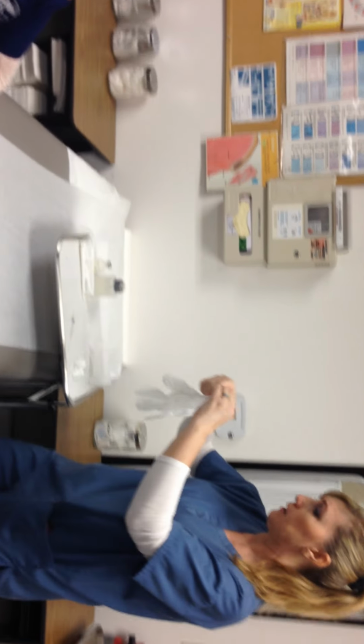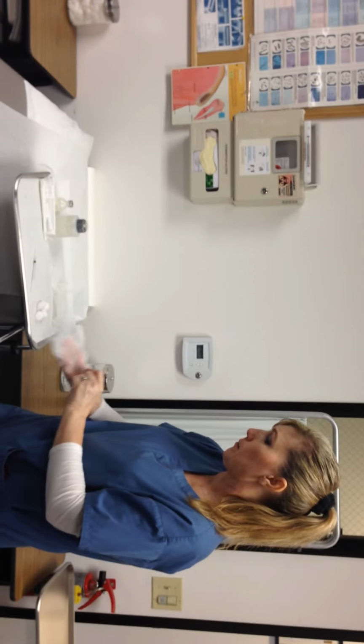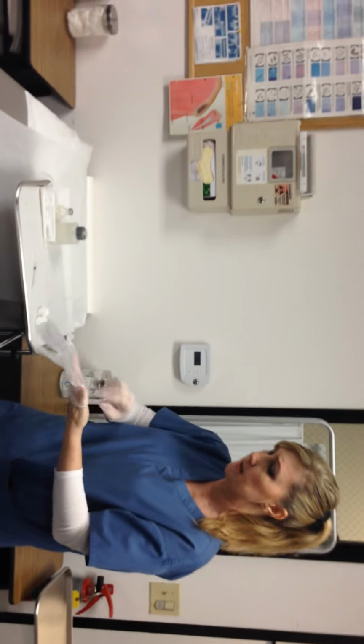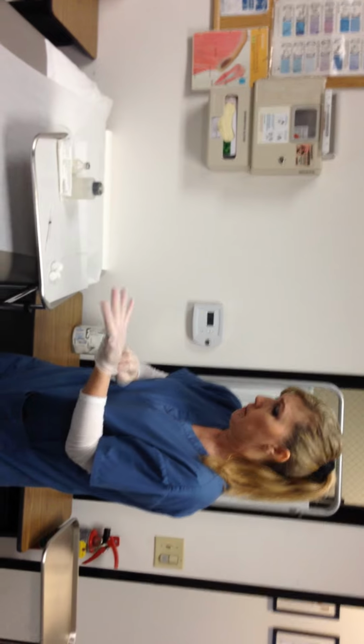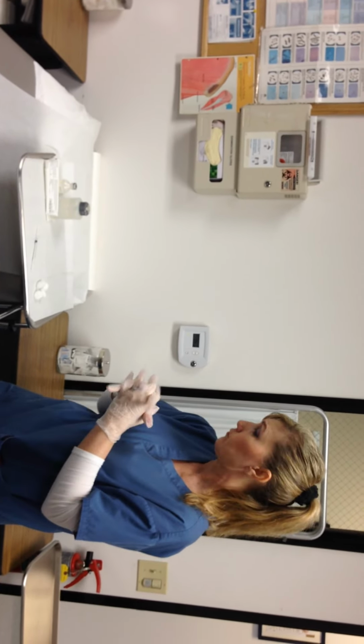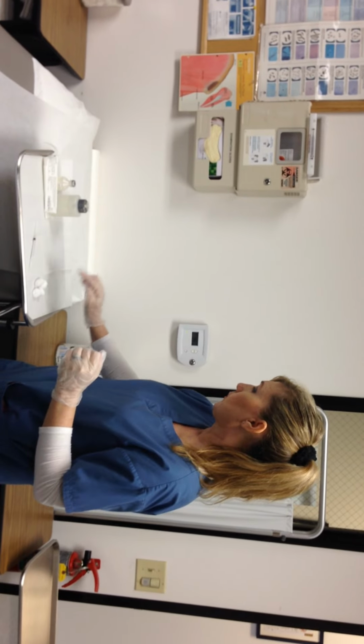So I'm going to put on my gloves. Notice I didn't have my gloves on when I drew up my medication. Why? It's not necessary. I'm not exposing myself to any blood, body fluids, right, with drawing of medications, and I already had washed my hands. So this is ready, this is ready, this is ready.